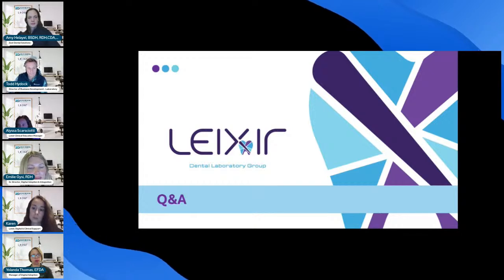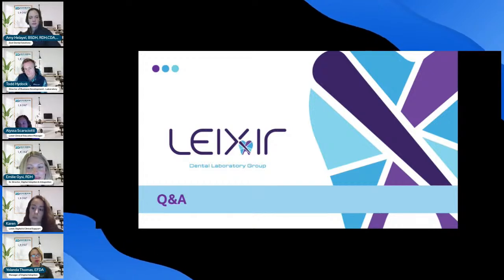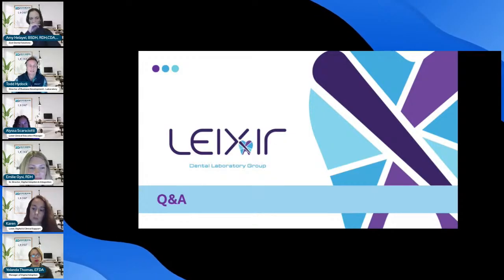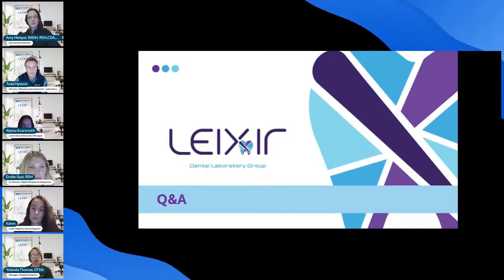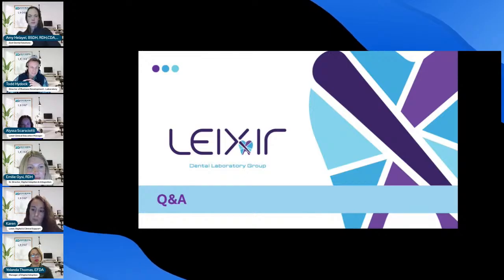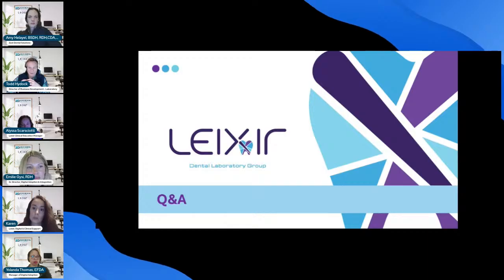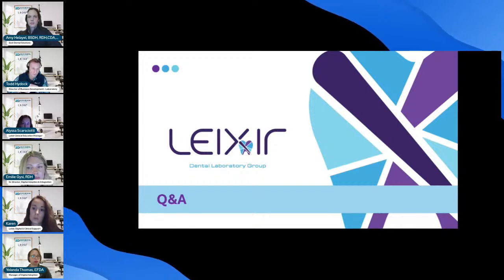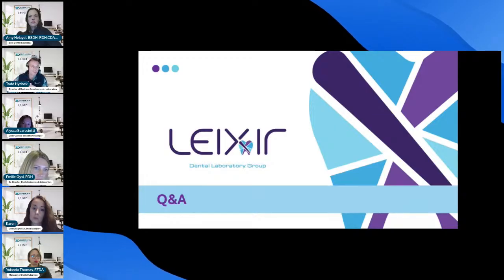Okay, and then the other question is, are the Zest locator scan bodies compatible for MUAs for hybrid dentures? So the answer is no. Those scan bodies actually snap over top of the locator. The key reasoning for this is to create the exact spacing that's needed inside the denture when the denture is fabricated digitally for the housing, as well as the material that you're luting the housings with. Now, if you're using a locator that's designed to go over the MUA, then you could still use the same scan body because it goes on top of all locator abutments.